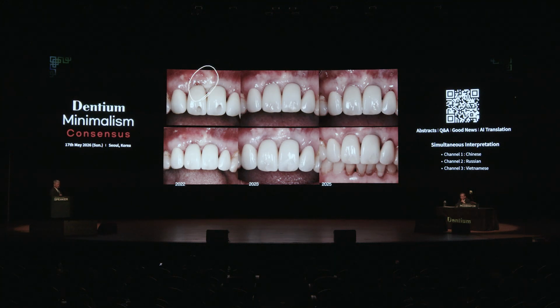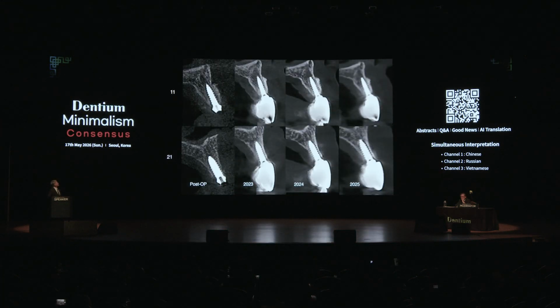But without any bone grafting, the gingiva is very thin, and in most cases where we place the conventional implant, there will be gingival recession and the bone will resorb in the crestal areas. But during the follow-ups, the very thin bone was maintained very well, and with the collagenate bone and the collagen graft it is very successful in the follow-ups. In the CT images, in the central, the 11 tooth area with the grafting is relatively well matured, and also in the 21 tooth area the labial bone, however thin, can be maintained very well.